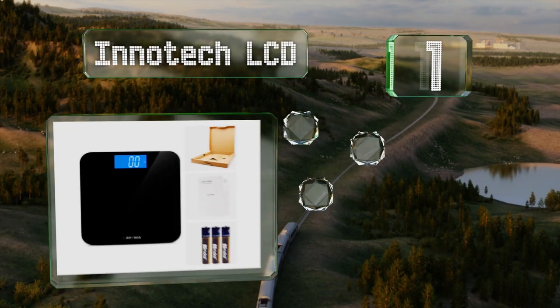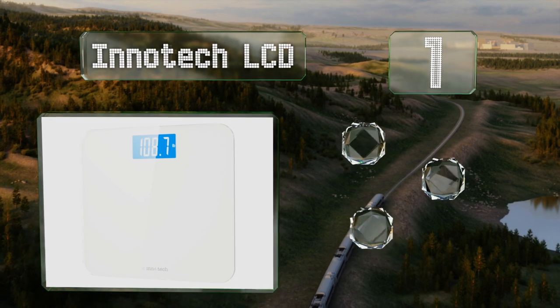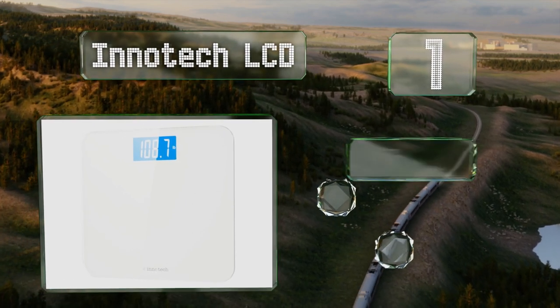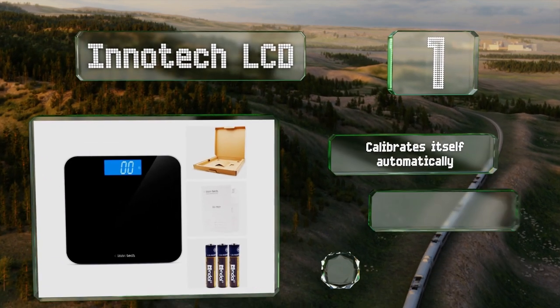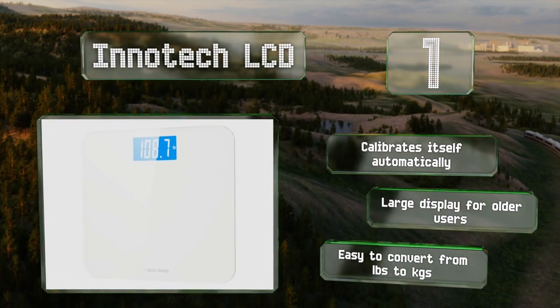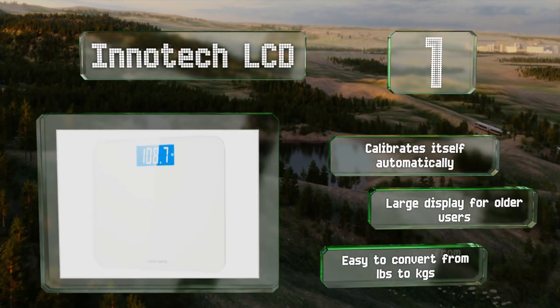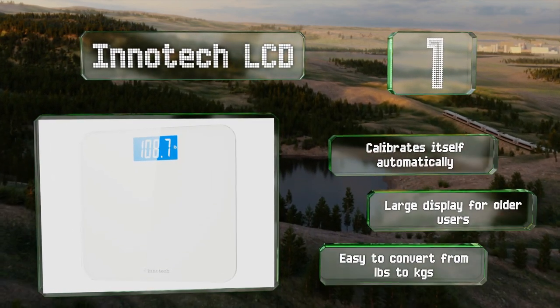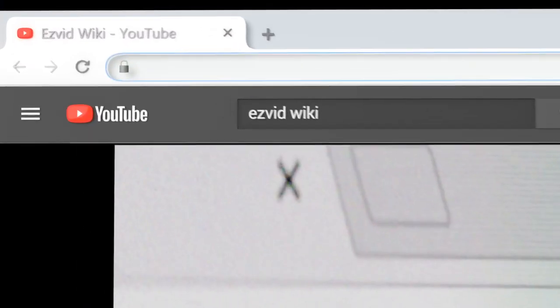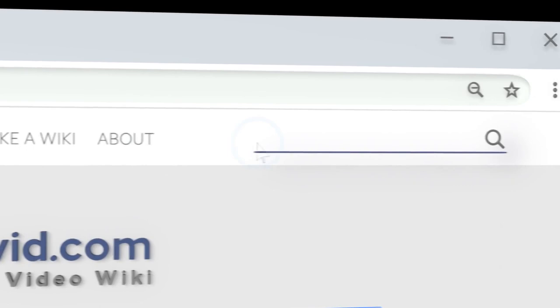Taking the top spot on our list, if you don't need bells, whistles, or every number under the sun, the Inner Tech LCD tells you how much you weigh when you step on it and that's it. It's a plain design so don't expect it to be the centerpiece of your decor, but you won't find better value for the money. It calibrates itself automatically, has a large display for older users, and it's easy to convert from pounds to kilograms.